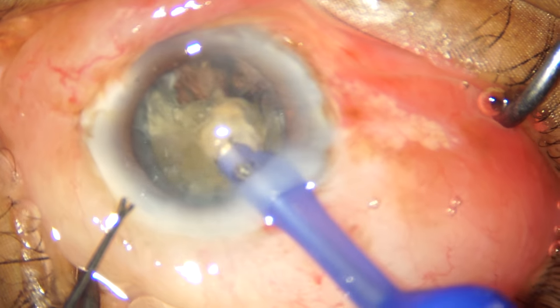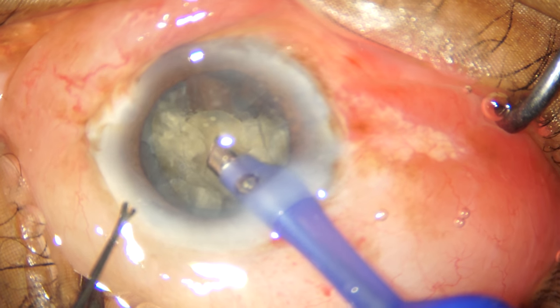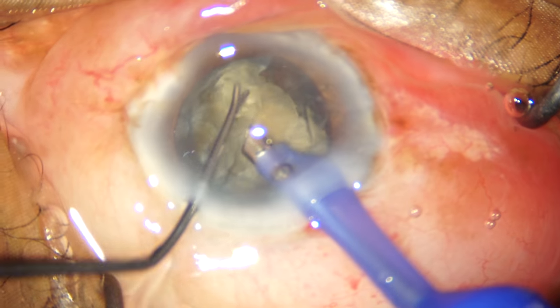Because I'm working on a pretty high vacuum, which is around 450 millimeters of mercury, we're getting good followability of the nuclear fragments.